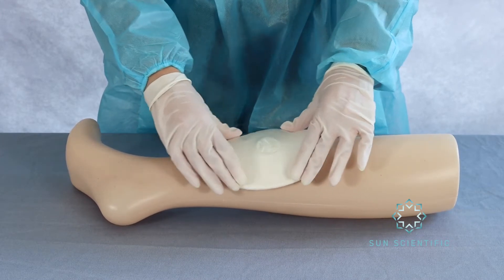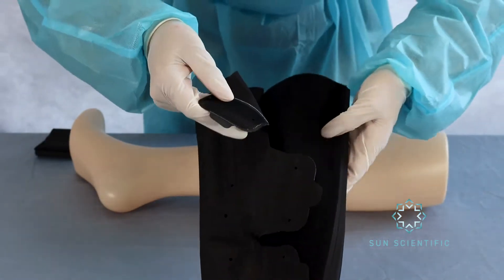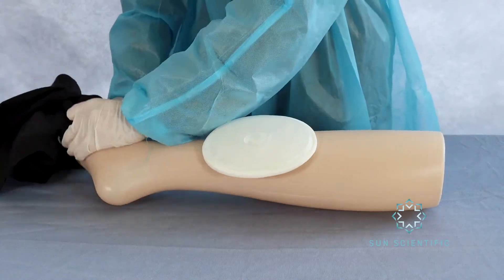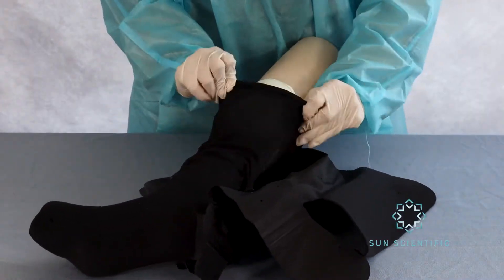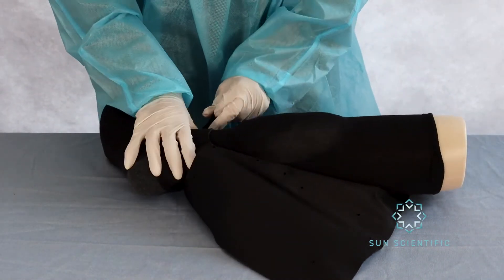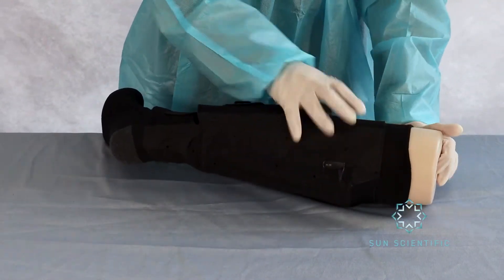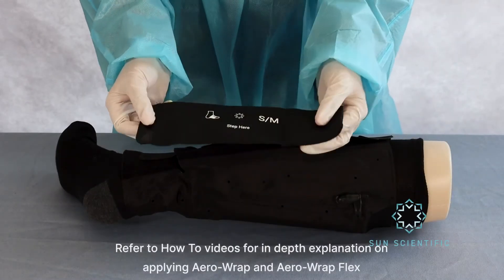Now apply AeroWrap. AeroWrap Flex is being used here because the wound is higher on the leg. For wounds around the ankle, AeroWrap with the attached foot portion and the Crescent PFAB are great options. Proceed to open the flaps and slide the understock or liner of your choice, securing the flaps around the lower leg, adjusting where needed so that the flaps are secured and on the front side of the leg.